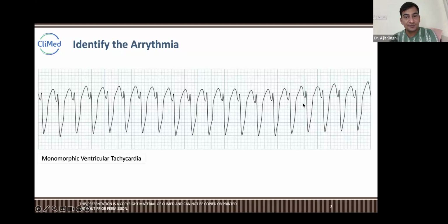Then why are these ventricular tachycardias? Why not atrial fibrillation or ventricular fibrillation or atrial flutter or SVT, supraventricular tachycardias? Why not? Supraventricular tachycardias and ventricular tachycardias are almost similar, but still, what is missing here?